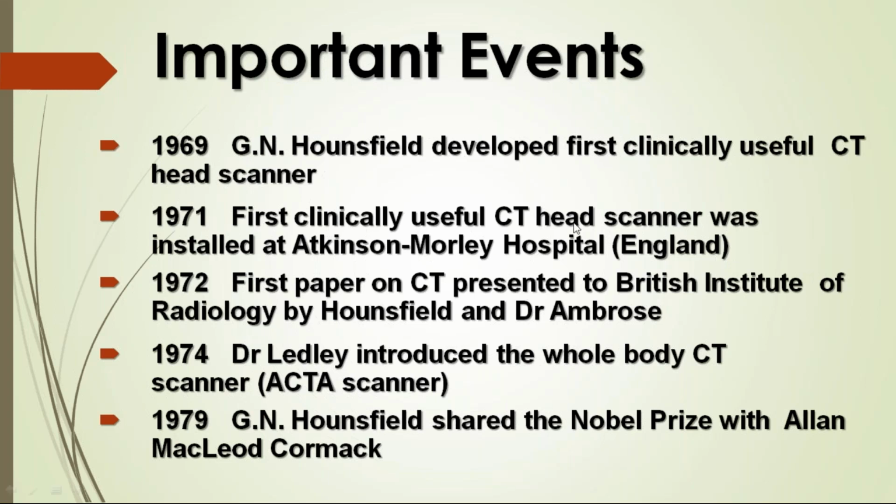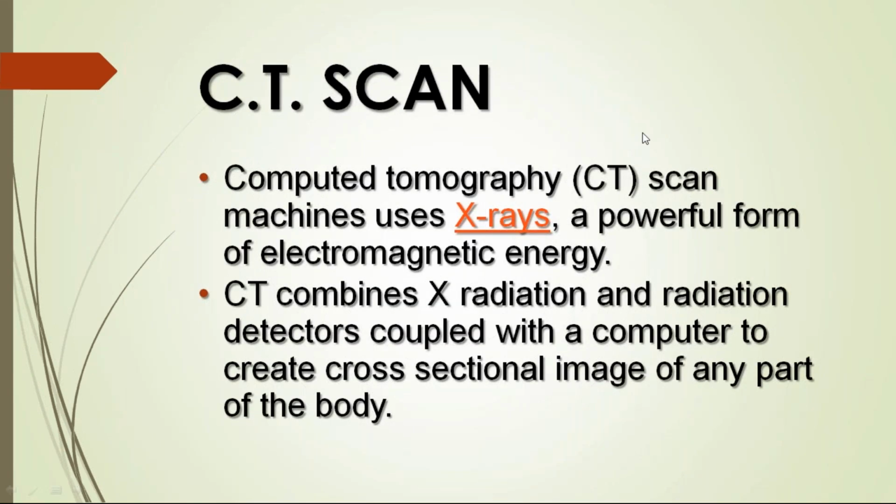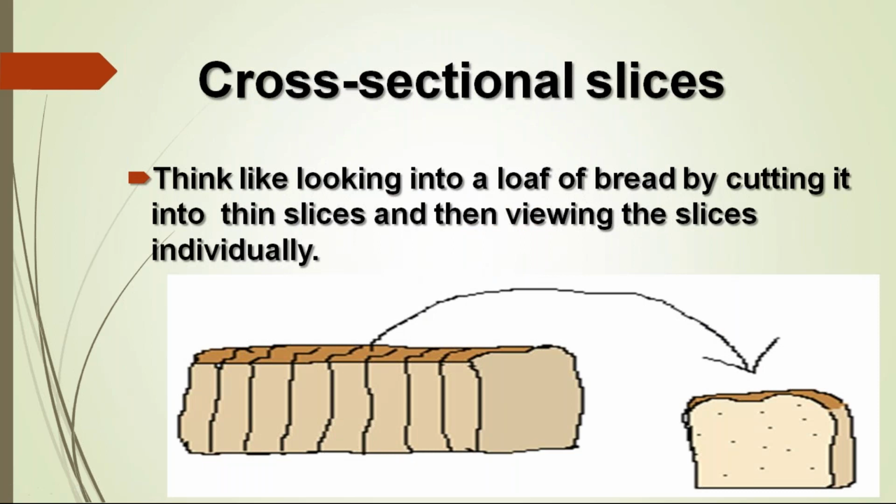After that, I will come to the basics of CT scan. CT means computed tomography. This machine uses normal X-ray radiation and creates cross-sectional slices. You will take cross-sectional slices in CT.